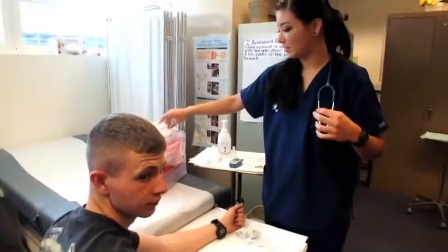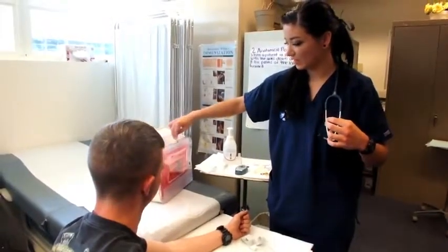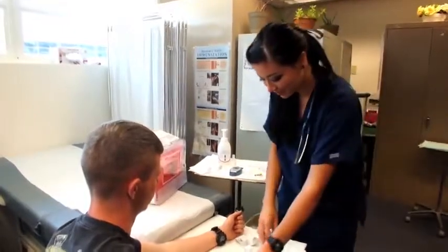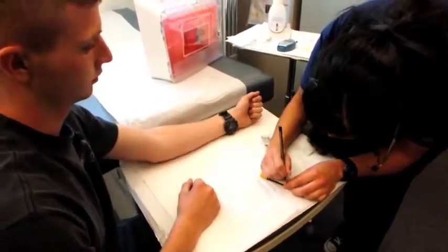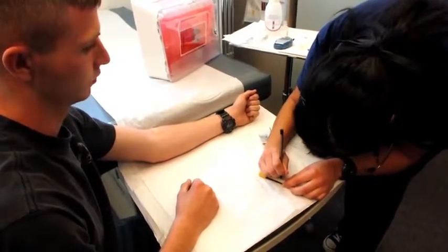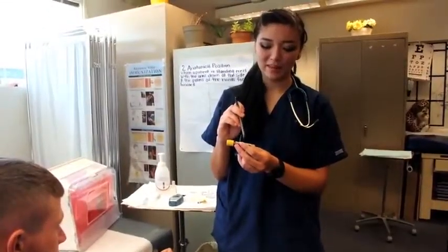You make sure to discard the needle properly in the sharps container and any bloody specimen. Alright, you want to make sure that you label the blood in front of the patient. So on the label you write the name, date of birth, and the date it was drawn.